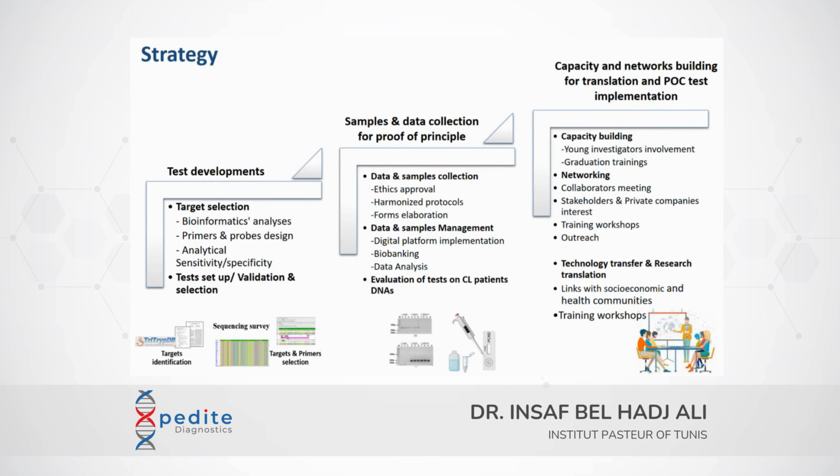So for test development, we selected and studied DNA targets that were selected depending on the test to be developed and the technology to be used. Then we collected data and well-documented samples from different study sites, including in Tunisia, Morocco, and Lebanon. And these samples were used for proof of principle and for test performance evaluation. And then we trained health personnel on these developed tests and built networks in order to facilitate the implementation of these tests.